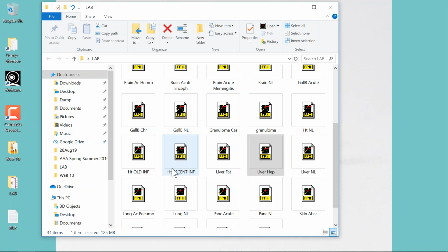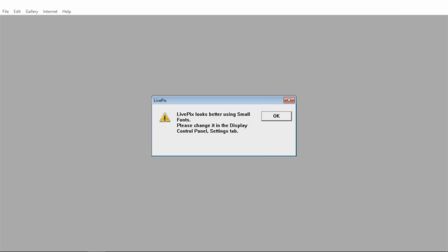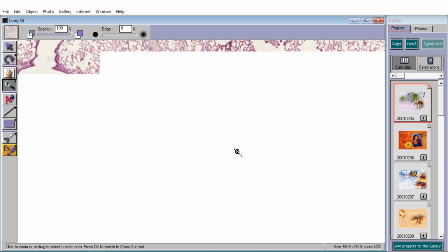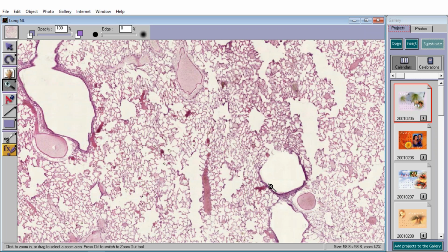And let's go into the world's most normal lung. Oh my God, how could you get a more normal lung than that? You can see there's three kinds of holes. There's holes that are lined by epithelium. Those are bronchi or bronchioles. There are holes which are lined by blood, and those are veins or arteries. If they're thin wall, they're more likely to be a vein, of course. And then there's holes that look like a little honeycomb pattern, and they're extremely tiny.